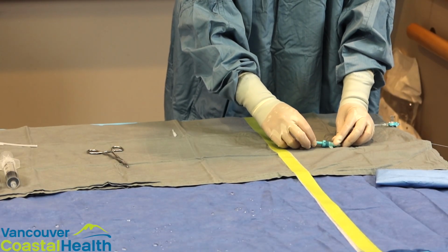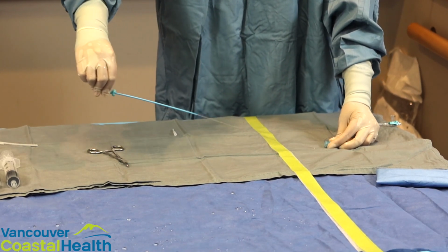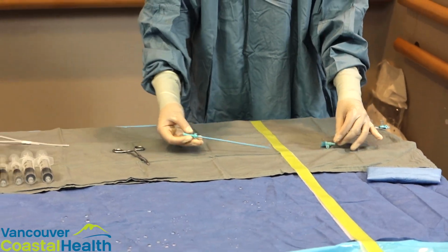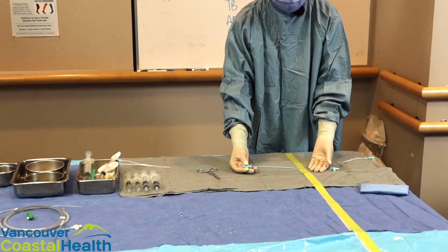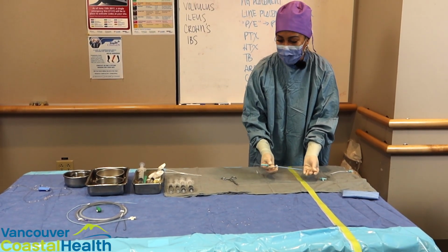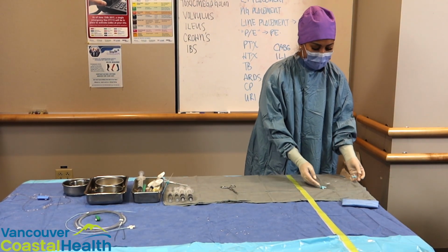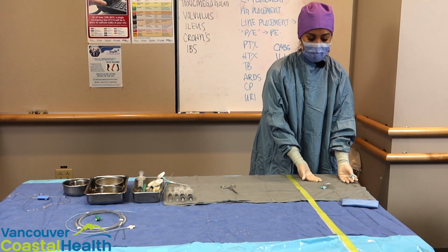So once your sheath is in, the wire and the inner dilator come out. The purpose of the wire was to guide our way into the tubular structure or blood vessel, and the purpose of the dilator was to smooth our entry into it, and these can now be set aside and shouldn't be used for the rest of the case. And now we have our access because we have our vascular sheath.